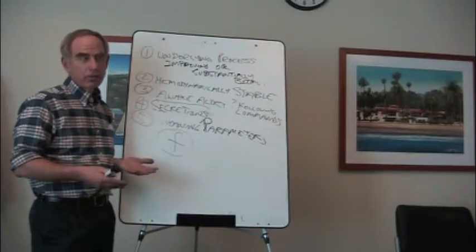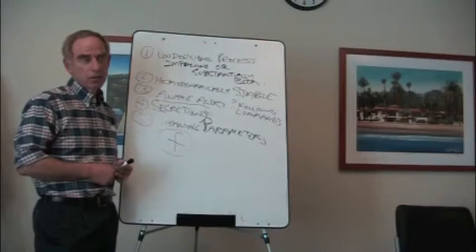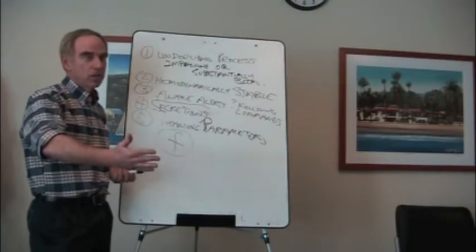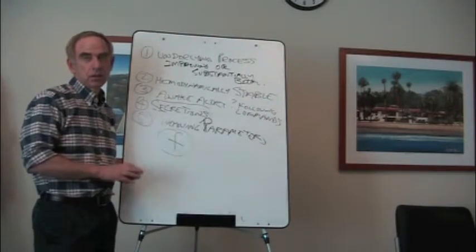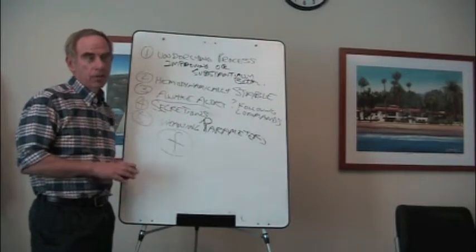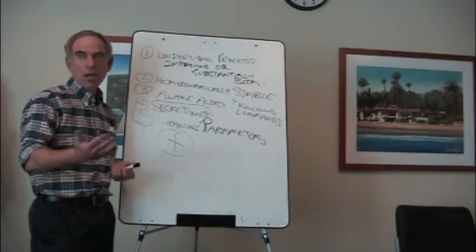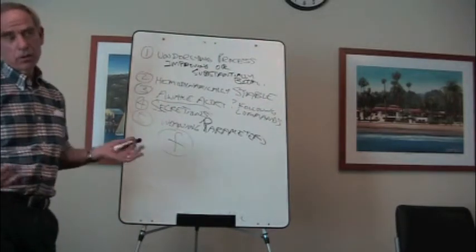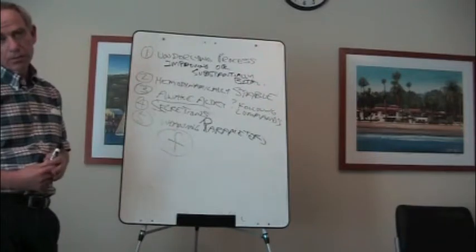These are really pulmonary function tests. They're pulmonary function tests for intubated patients. Just like we do complete PFTs on outpatients or on inpatients that are not on ventilators, these are pulmonary function tests. That's really what they are. They tell you something about different aspects of your patient's lung function. And so if you understand them and what might be causing individual problems, you will be able to treat your patient better. Okay, so that's weaning parameters.